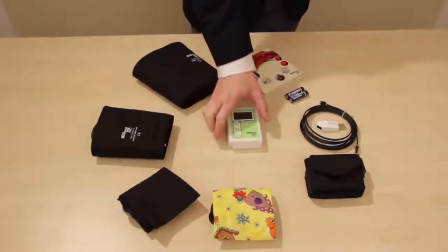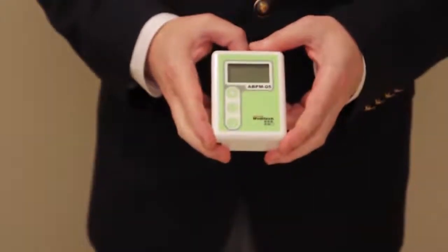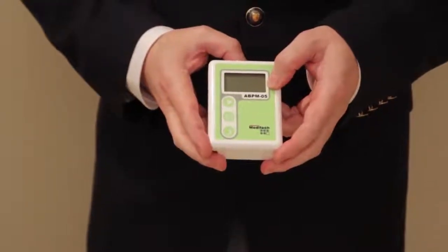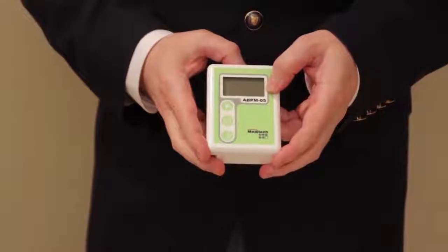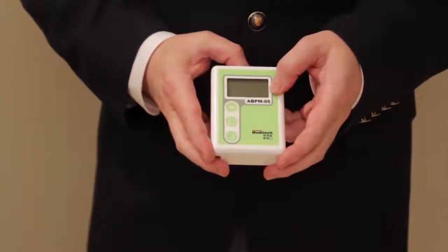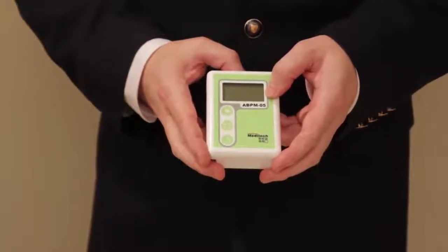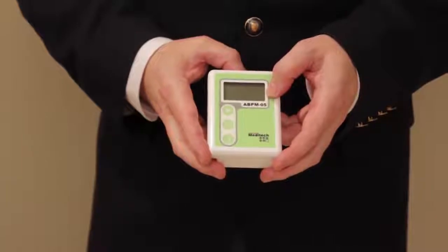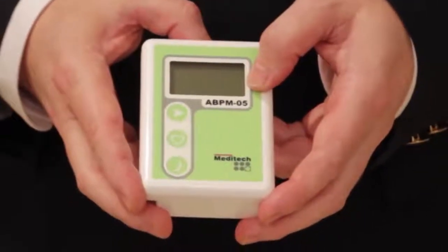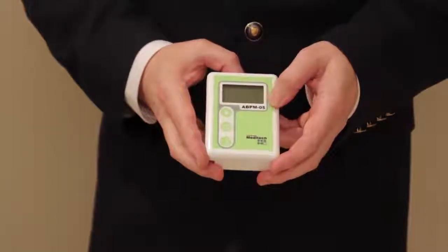The device itself is, as I said, small and lightweight. It has a relatively large size LCD, which will show you everything that you need to know during the operation of the device: programming information, computer connection information, the individual measurement results, and if there are any errors, it will also show error codes. The device has 3 buttons.